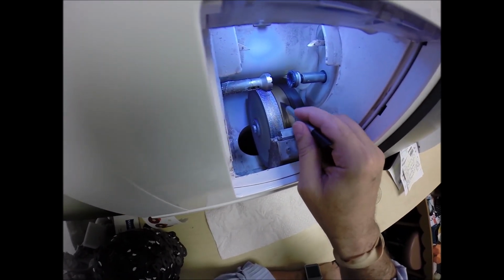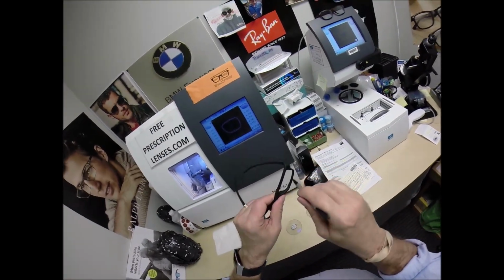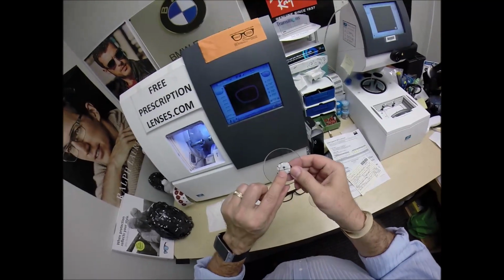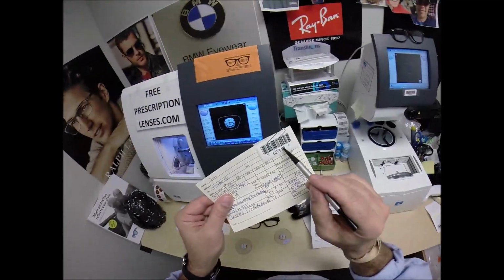This wheel in the center that has the channel, that valley, that's what's going to put the V-shaped bevel onto the lens so it stays inside the bevel of the frame. So now the magnet, well actually let's wake up the computer. Job ID number 2349.